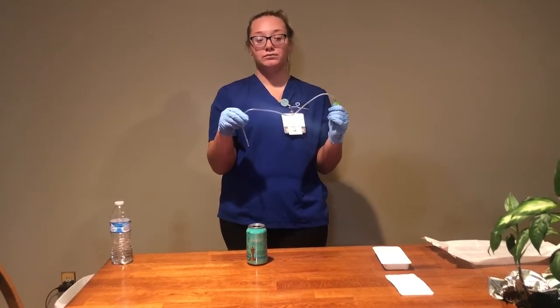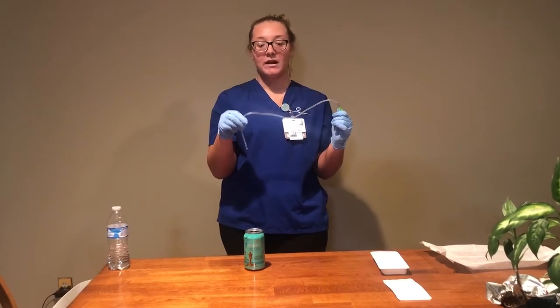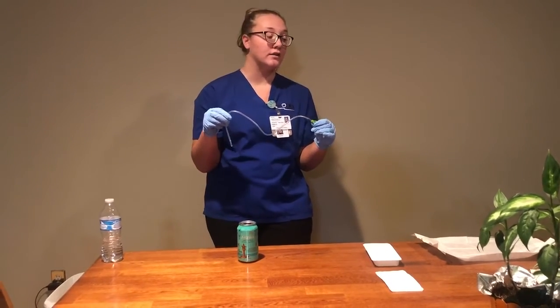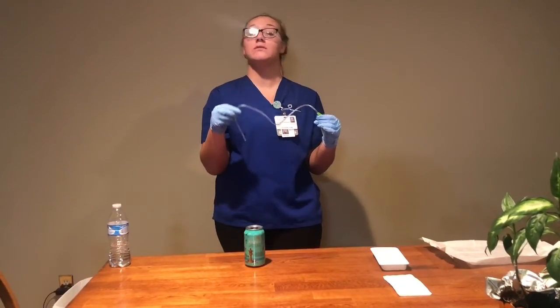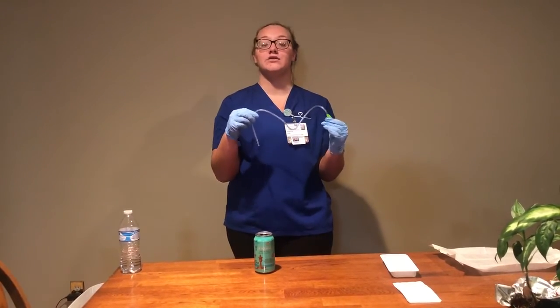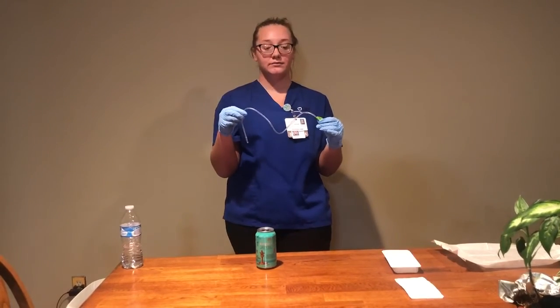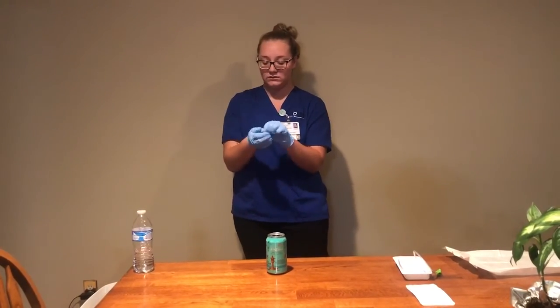And then so after that, I would turn off my suction, and then I would also reassess my patient's respiratory status. So I would make sure that they were breathing at the same rate they were before, and make sure they're taking some deep breaths. And then after that, I can get rid of this, and then I can take off my gloves.